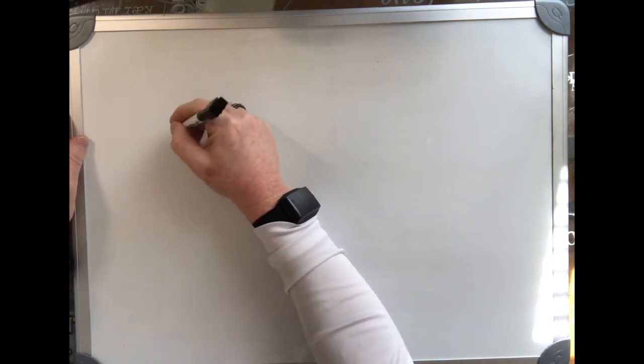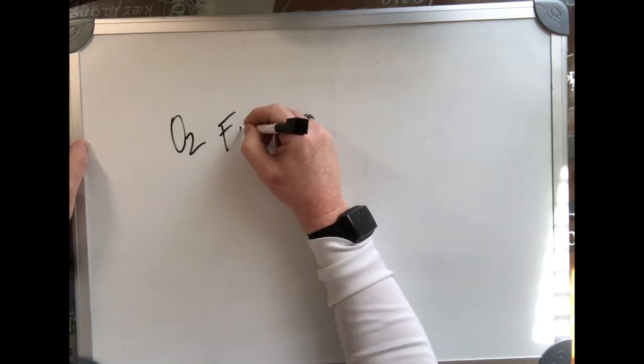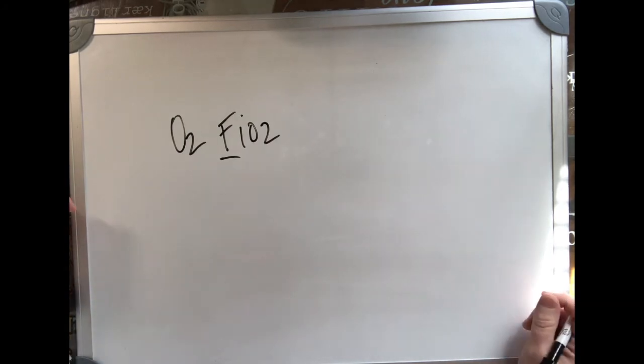Hey guys, back. We're just going to go over settings for hypoxia versus settings for hypercapnia, hypocapnia. So just to get right back to it, when we're looking at O2, basically what we're looking at is FiO2, which is the fraction of inspired oxygen. You could have somewhere between 18 and 23% of oxygen in this room. The rest of the gas is nitrogen and other gases.